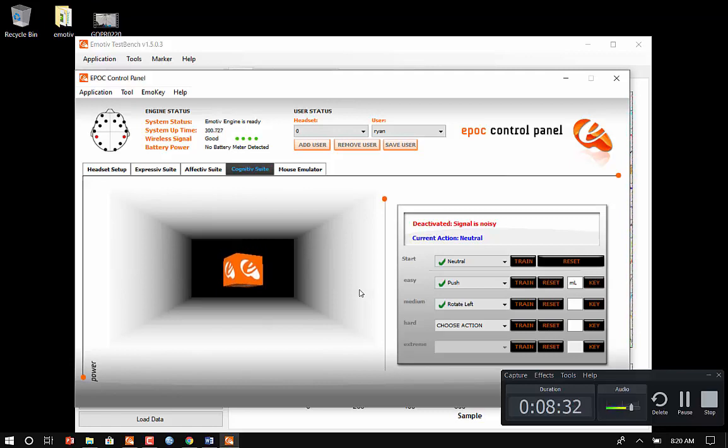So here's the annoying part. Does this take effort? Yes. You actually have to go. Okay, so think about pushing. Come on, you can do it. There you go. You got it. Oh, it's rotating. Come on, push. Think about doing a push-up, or think about pushing with your hands, or pushing with your arms. The computer's saying, rotate!